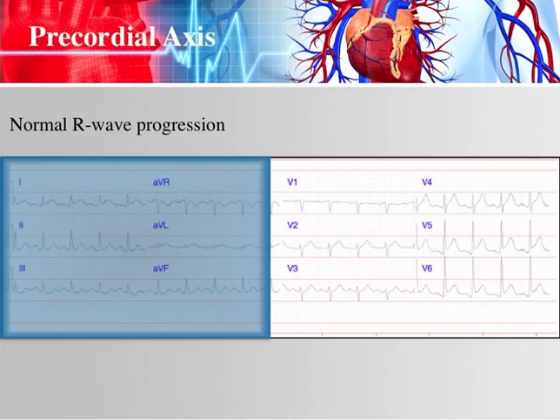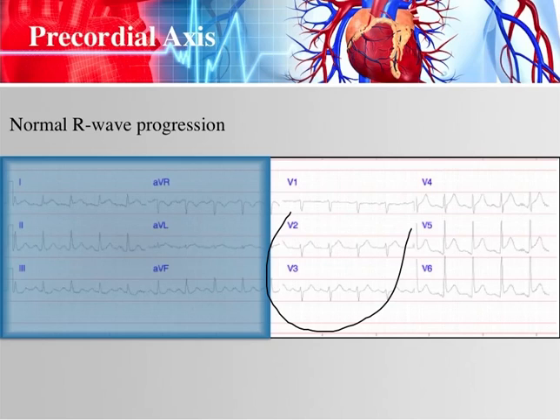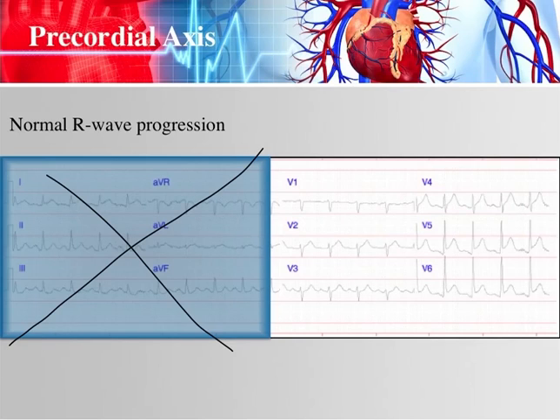Here's an example of normal R wave progression. We see mostly negative in V1, mostly positive in V6, and the transition occurs somewhere between V2 and V4 — V2 is mostly negative, V4 is mostly positive. That's normal R wave progression. We're not paying attention to the limb leads for this discussion.